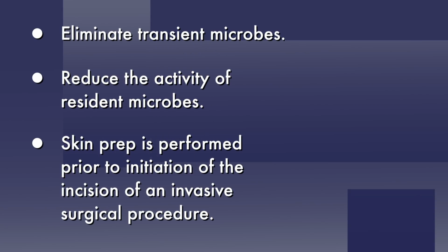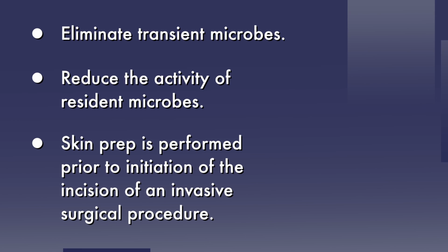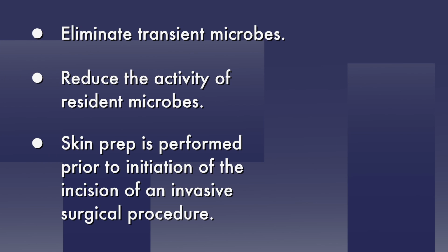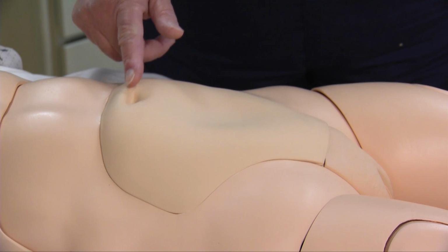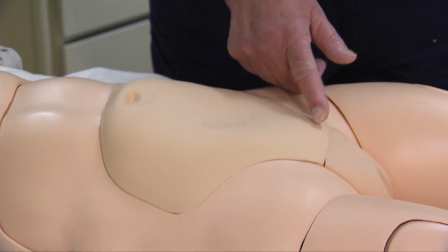The purpose of performing the surgical skin prep is to eliminate transient microbes and reduce the activity of resident microbes on the skin. The skin prep is performed prior to initiation of the incision of an invasive surgical procedure. An abdominal prep to accommodate a lower abdominal midline incision will be demonstrated.